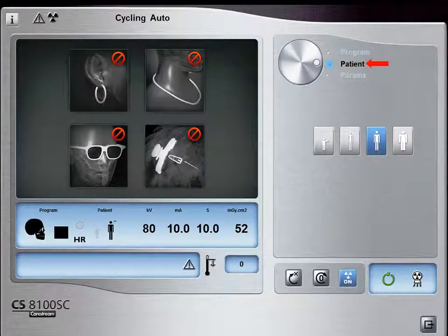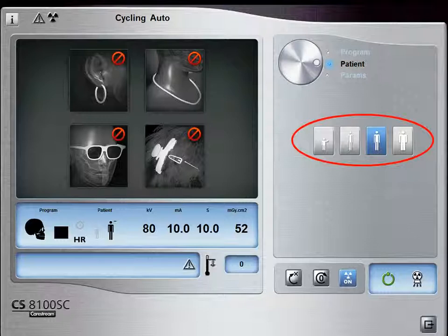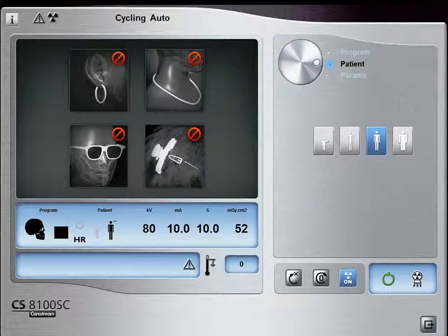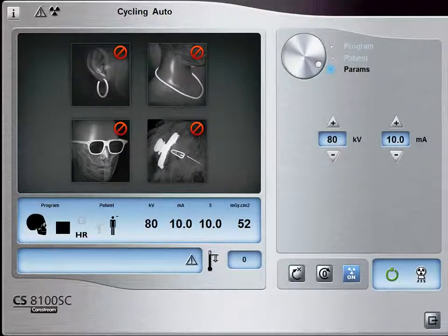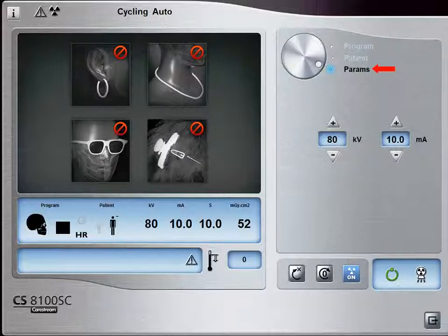Select the Patient button to access the patient pane. Select the patient type and size: Child, Small, Medium, or Large. If the default KV, MA, and seconds settings are not correct for your patient type, click the Parameter button and select the appropriate parameters. Select here to fine-tune KV, and select here to fine-tune MA.